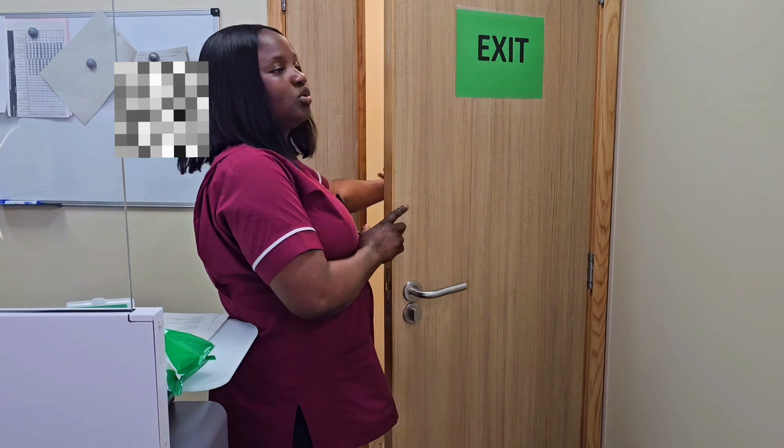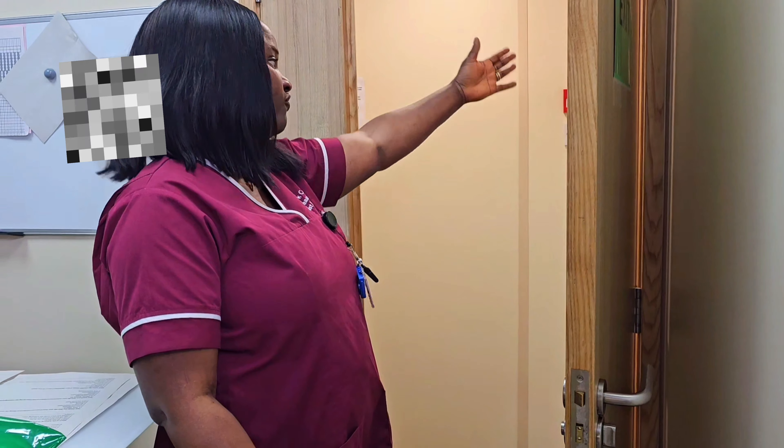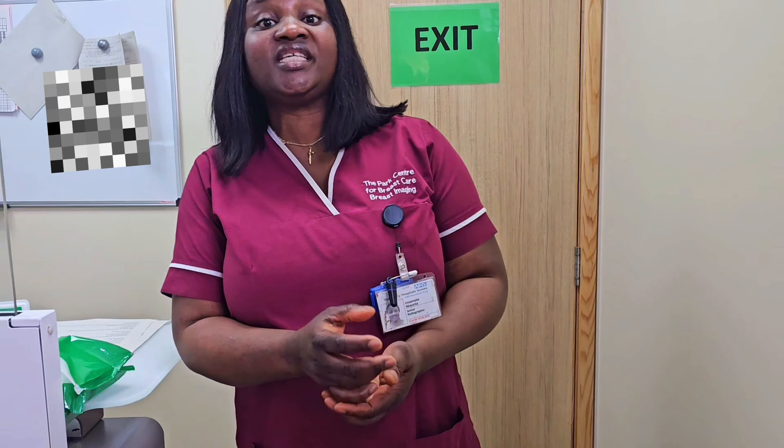You will then be allowed to get completely dressed before you leave. And so, this is what to expect when you come for your screening mammograms — what we call breast screening in the UK.